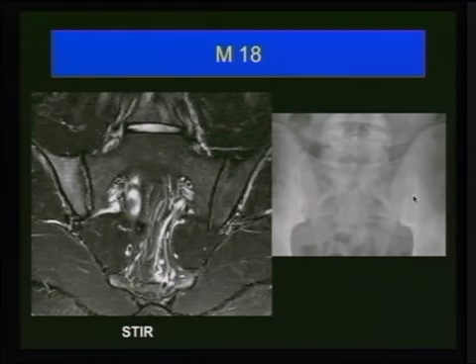So on the right side, we now want to confirm our diagnosis. We have unilateral sclerosis, which means it is grade 2. There is no significant erosion here, so there is sclerosis. Now we go to the coronal STIR image. This is not really a good coronal oblique, which is why you don't see the whole length of the sacroiliac joint.